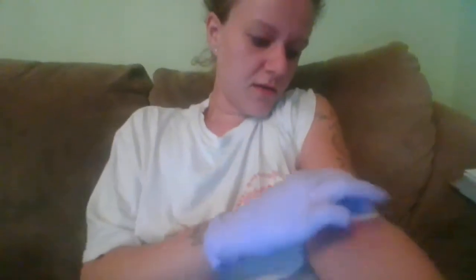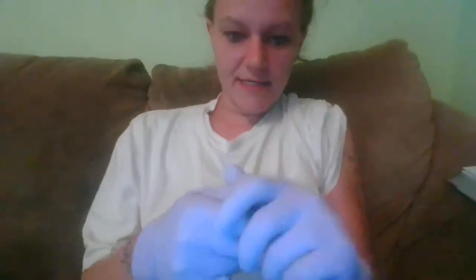Then I'll take my alcohol swab and clean it real good once I find a good vein. Leave it alone once you find the vein. Don't need to tap it or anything else again. I'll then take the cap off my needle, which I've already set up. It's already screwed into the tube. I'm going to ask my patient to make a fist also, just to help the vein come up.